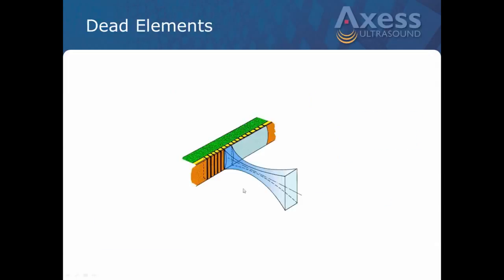And if you look up in here along the skin line, there's a lot of averaging that has to go on in CMUT. The machine has to average the signals a lot more than in a PZT array, for example. But overall, it's not a great difference. It's just going to give you a smoother looking image. I've spoken to some people on the clinical side, and they're a little concerned that they might lose some detail with this type of technology.